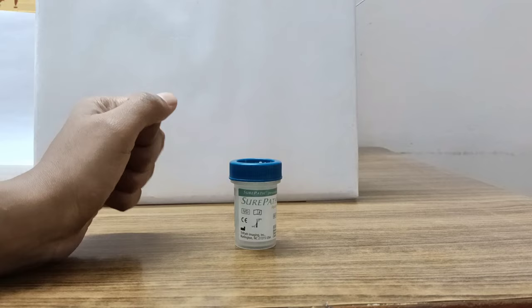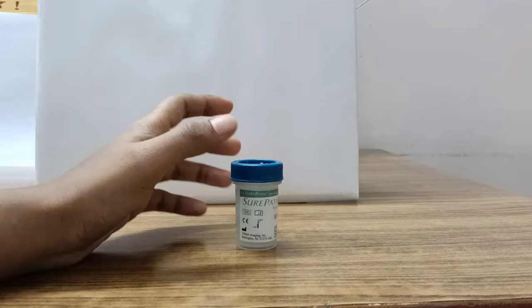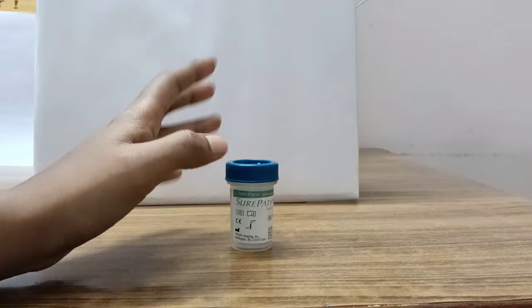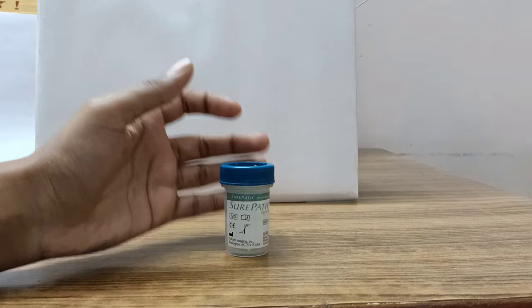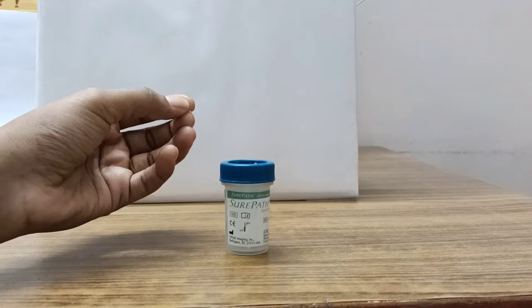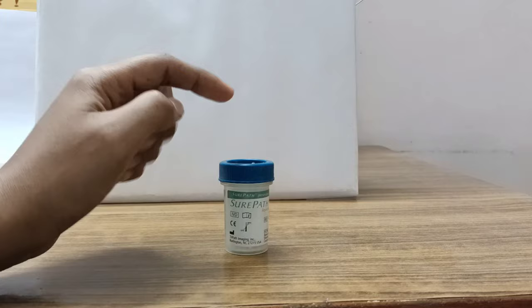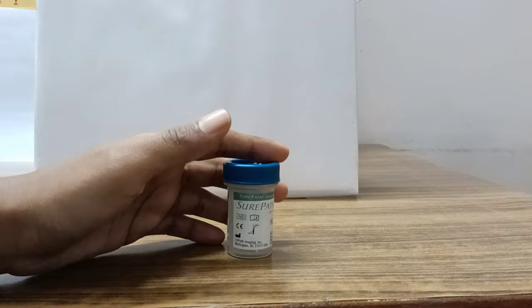In the presence of blood or mucus discharge, those cells get separated from the endocervical cells in this method. Also we can go for HPV DNA testing in this vial, so it has a few advantages over the pap smear.